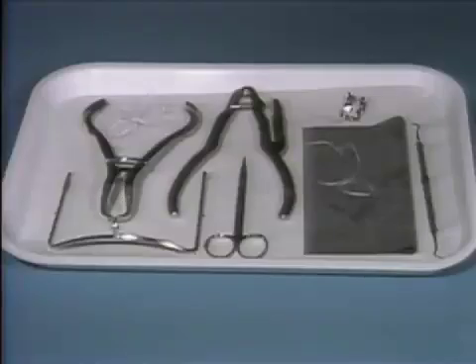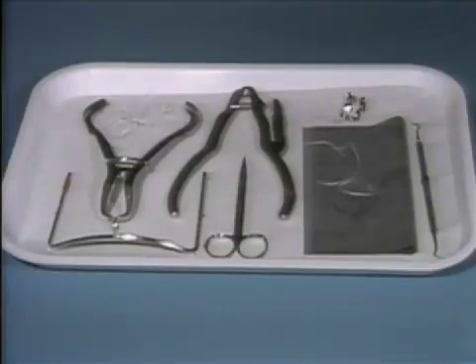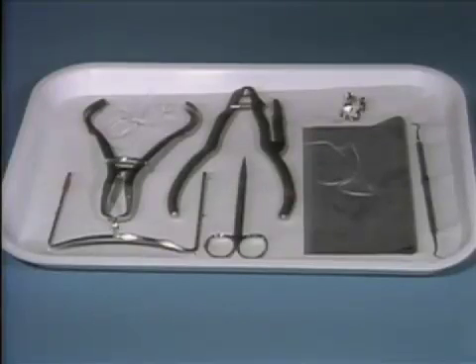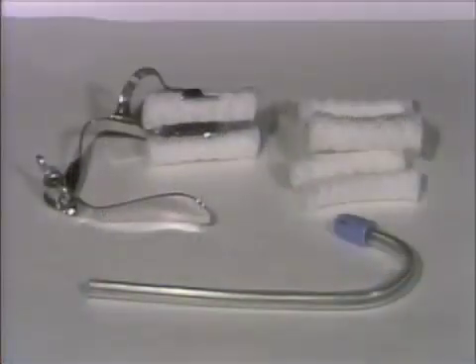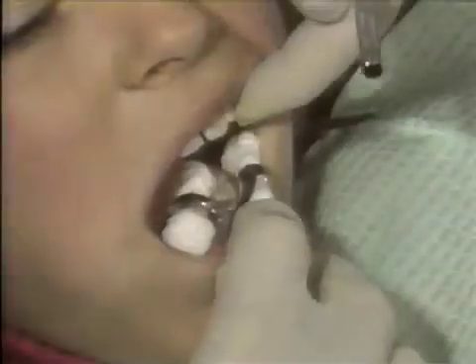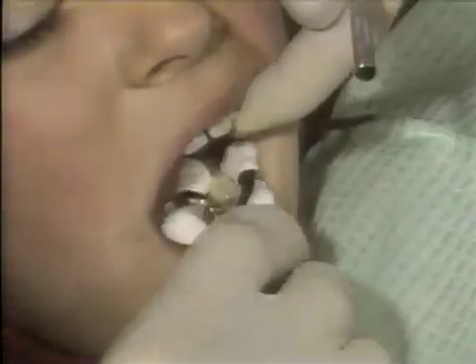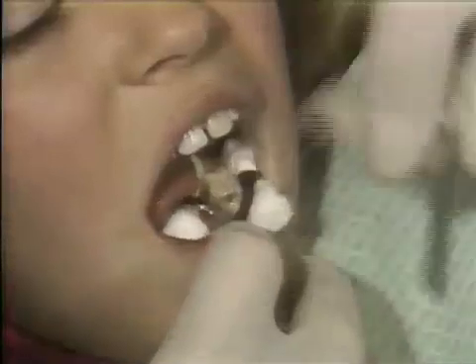Isolation is achieved most effectively with a rubber dam. However, cotton rolls may be more practical and can provide equally effective isolation if a meticulous technique is used.